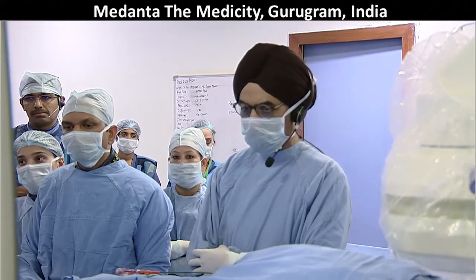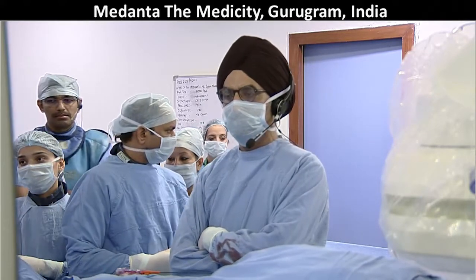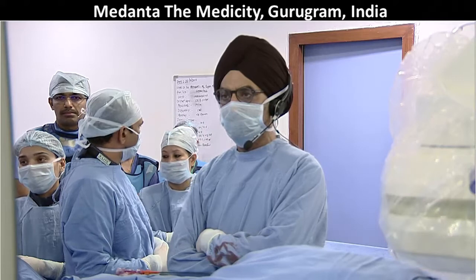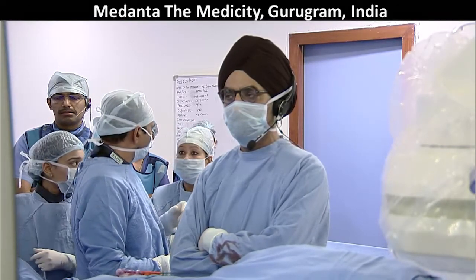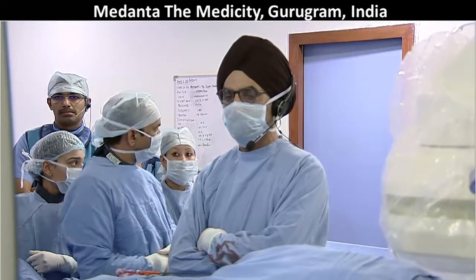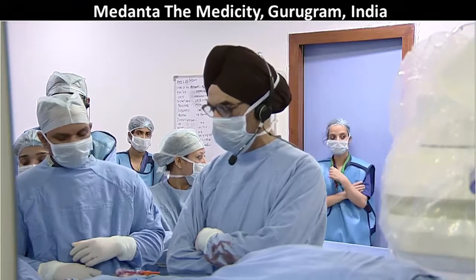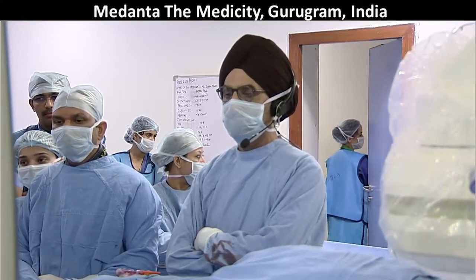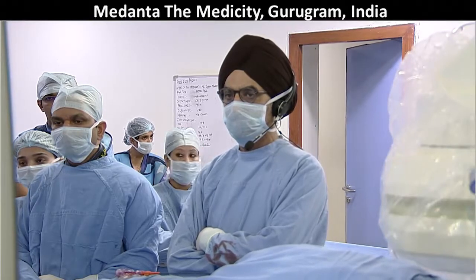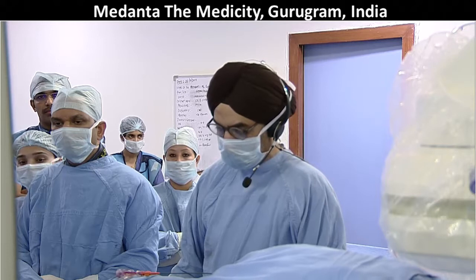The lesion in the mid LAD seems to be critical, and in the ostial LAD, the options are, first, if you have a DCA, of course, this is a good case for DCA. And second, if we don't, then probably we can implant a stent crossover from the LAD to the left main, crossing over the circ ostium, because the circ ostium seems to be healthy.